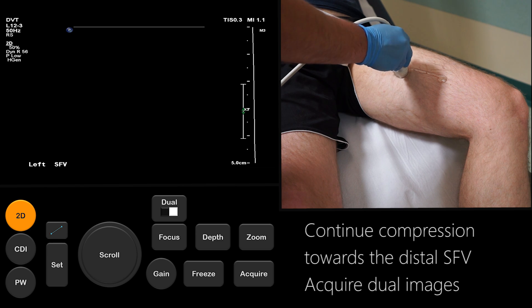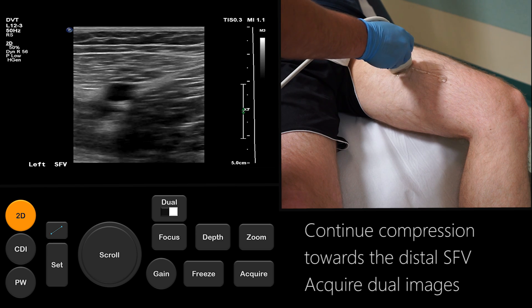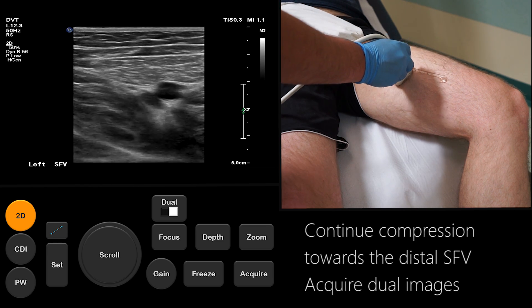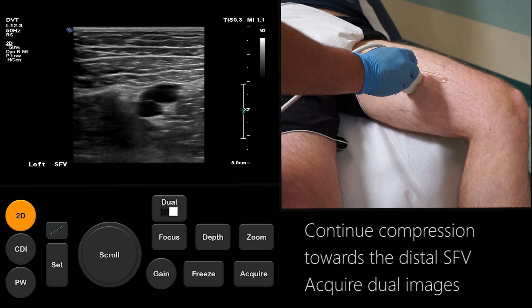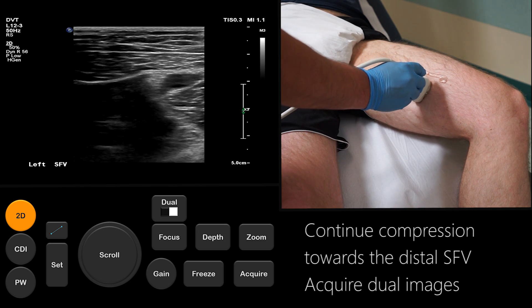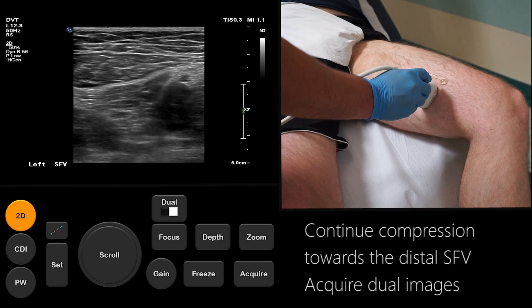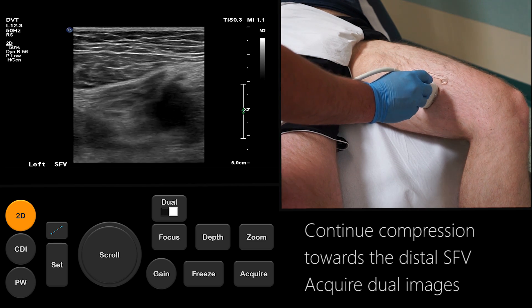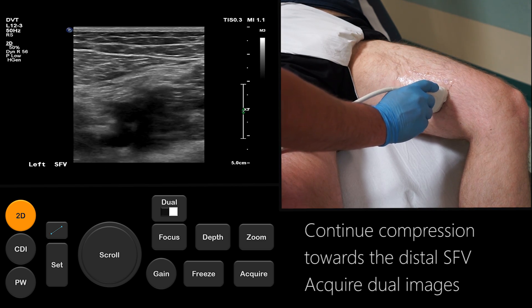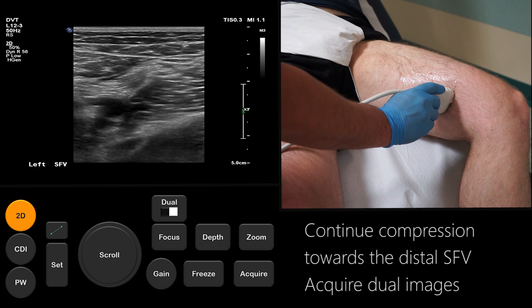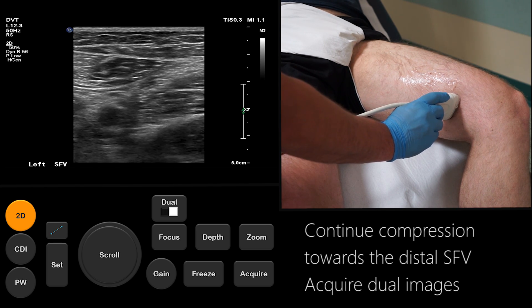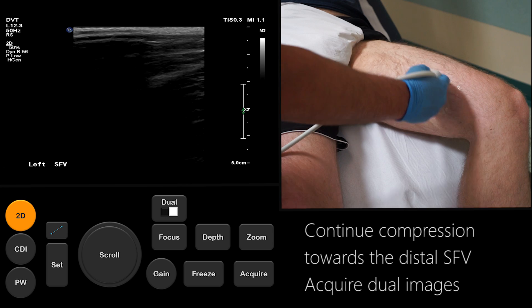Continue in transverse section, compressing the vein towards the distal SFV. It can be difficult to see the distal SFV as the vessel dips towards the adductor canal. Support the lateral thigh with your left hand and squeeze towards the probe to aid compression. To acquire an image using this technique, freeze the image after compression and scroll back through the cine loop to find the point of maximum compression.